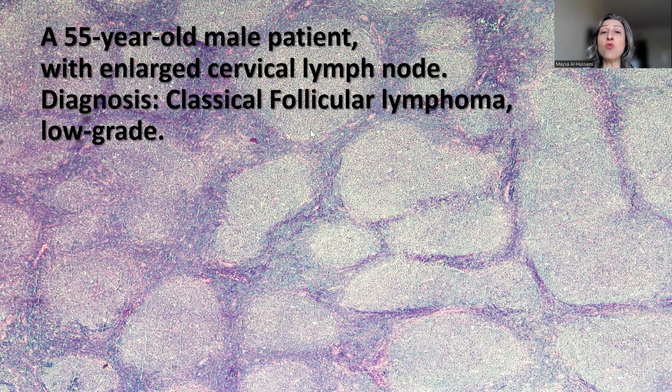What is very important is to pay attention to the presence or absence of any diffuse areas of growth versus the follicular areas of growth, as in this case, and always pay attention to the immunohistochemical stains, the distribution of the Ki-67, the positivity with BCL2, and the strong positivity with CD10, because these would strongly support the diagnosis of follicular lymphoma versus reactive conditions.